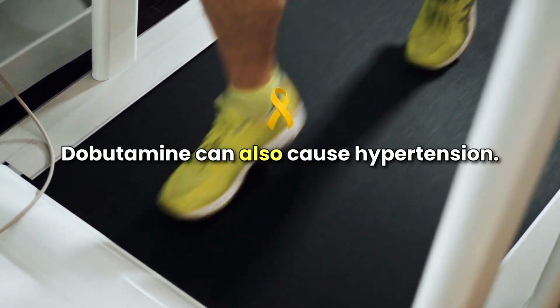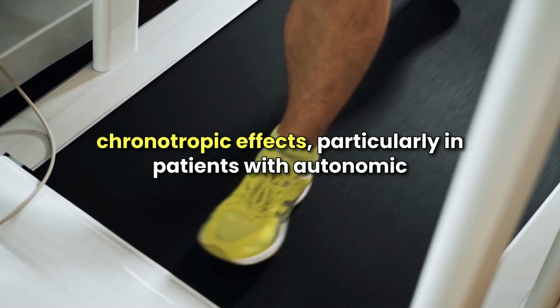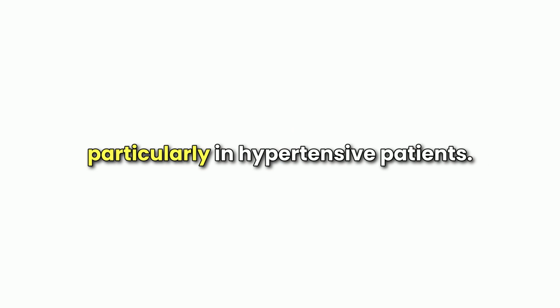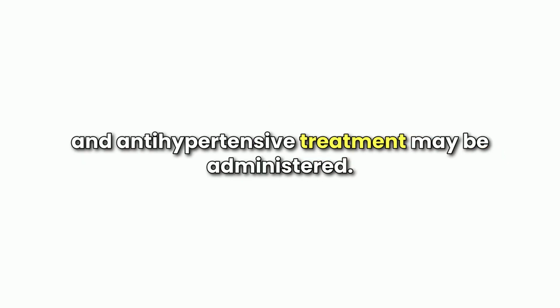Dobutamine can also cause hypertension. This is due to its inotropic and chronotropic effects, particularly in patients with autonomic dysfunction or pre-existing hypertension. Elevated blood pressure may increase the risk of stroke or other complications, particularly in hypertensive patients. The test can be paused or stopped if blood pressure rises excessively, and antihypertensive treatment may be administered.